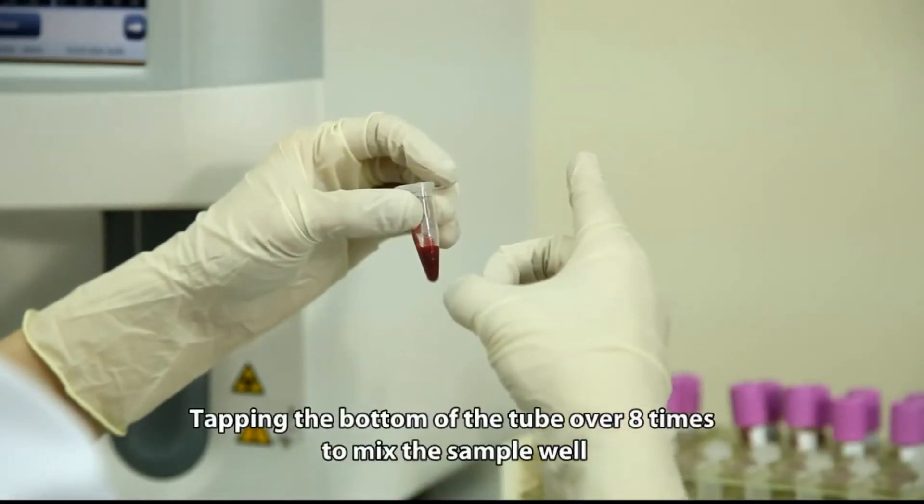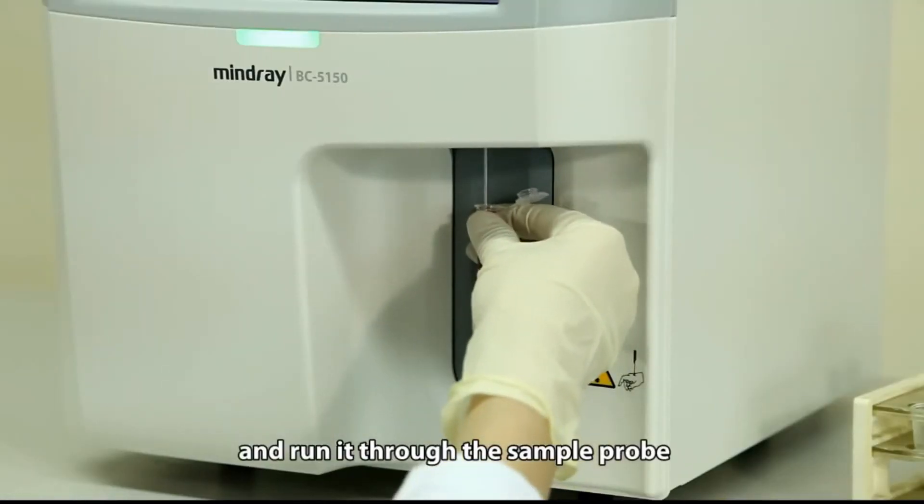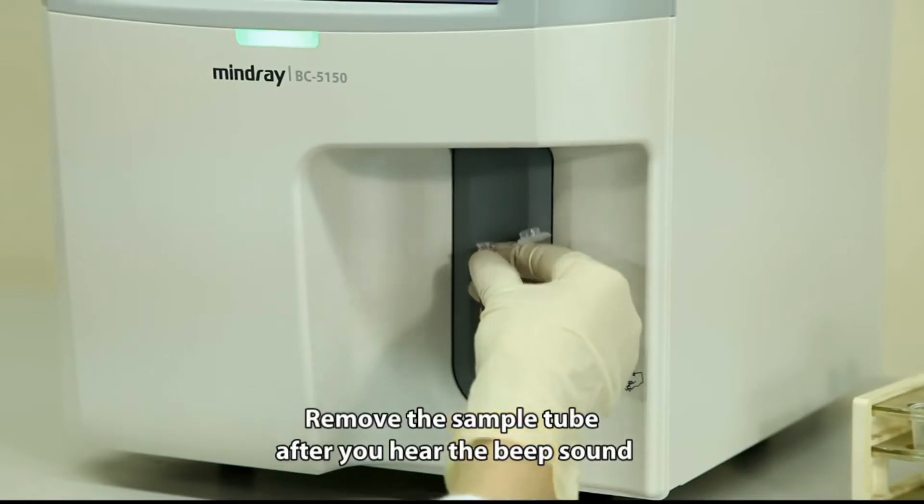Tap the bottom of the tube over 8 times to mix the sample well and run it through the sample probe. Remove the sample tube after you hear the beep sound.